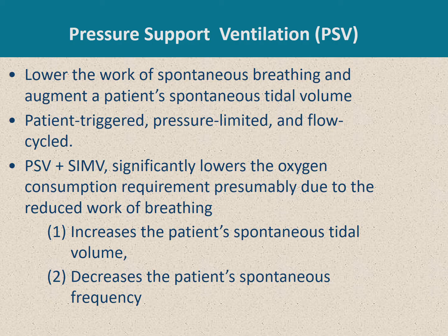It's a patient triggered, pressure limited, and flow cycled ventilation, aiming to give support to the patient, lower the work of spontaneous breathing, and augment the patient's spontaneous tidal volume, mainly used during weaning.